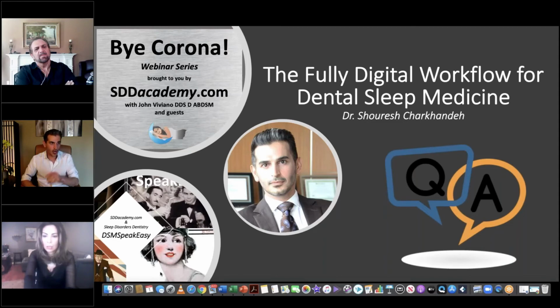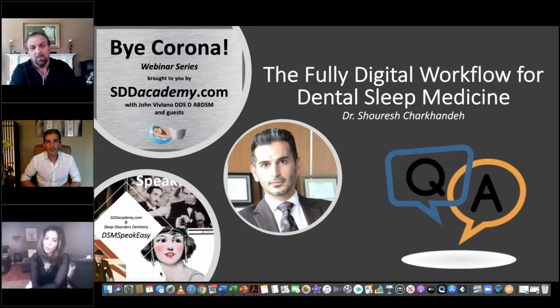As far as I understand, John, you might be the best person to answer that one. I don't believe you can capture both the joint and the airway in one image, which is a challenge. And hopefully we'll see some changes with the low-dose radiation. I think that's two different views. My understanding is two different views. I don't have a lot of experience with that, but yeah.